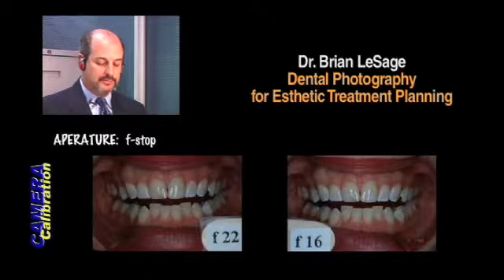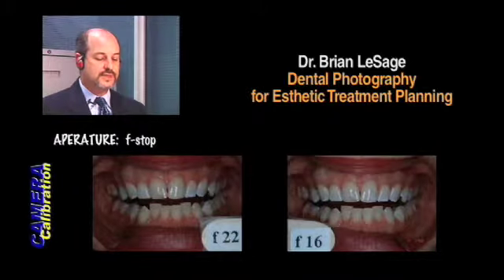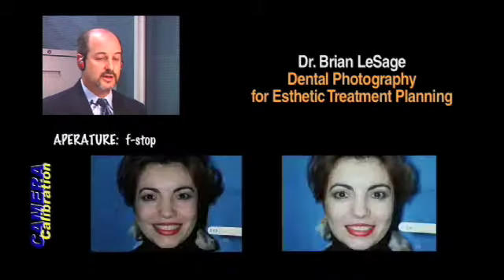Really it's between these two, the f22 or the f16, I think is the best exposure on this 1:2 view with this camera. This is the Yashica Dental i3 with this film, because film plays into this also.